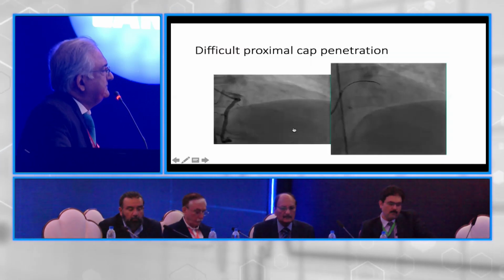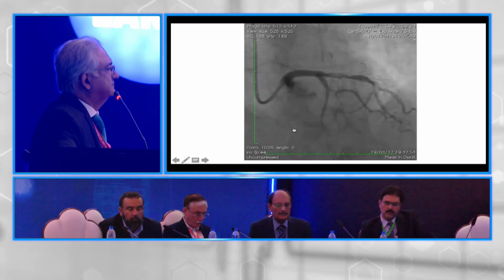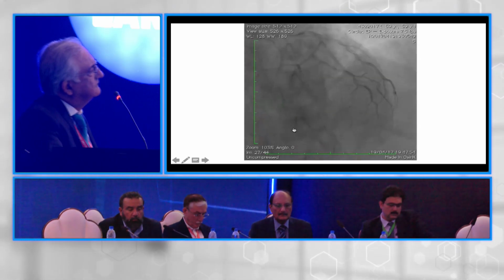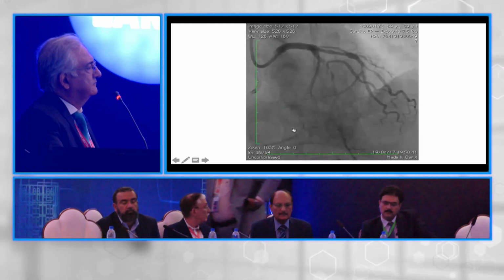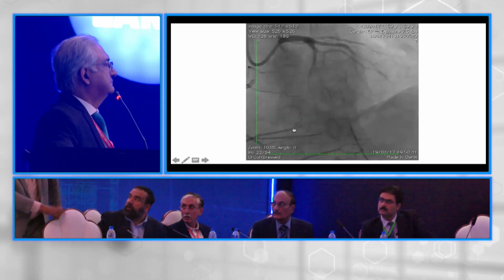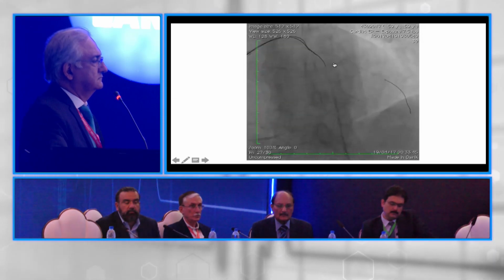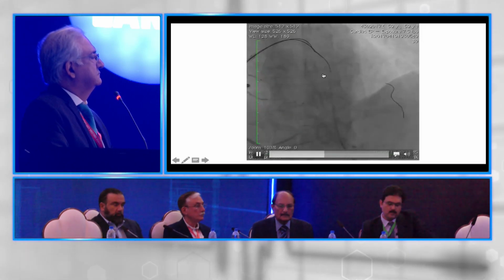So let me show you one parallel wire technique, which I think is quite useful. I'd like to finish with this case. This is another LAD CTO case. This is antegrade injection. With bilateral injection, it seems not that difficult a case, right? We have a channel. It shouldn't be that difficult to wire with a hydrophilic wire. In bilateral injection, we obviously have a channel. Maybe here we have a very small CTO. And unfortunately, the wire could not find that channel and ran into the subintimal space here.